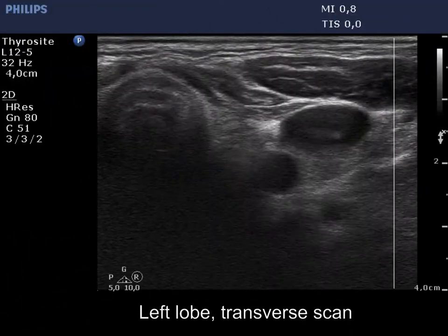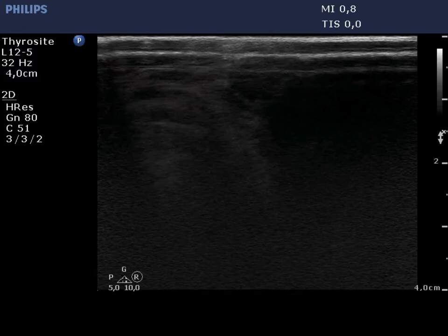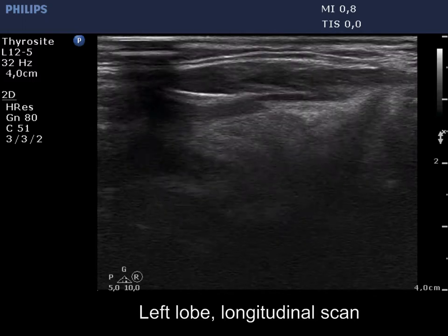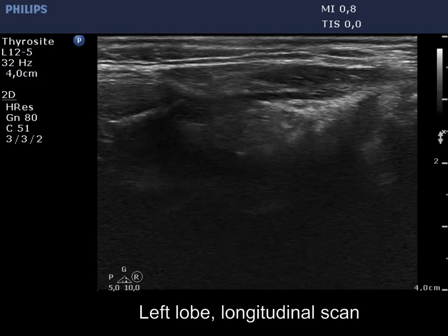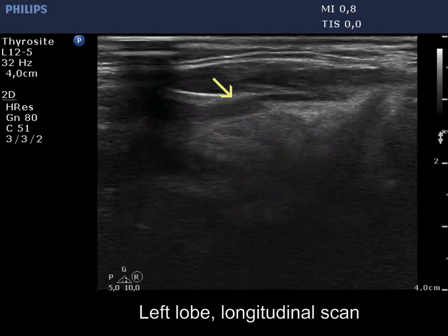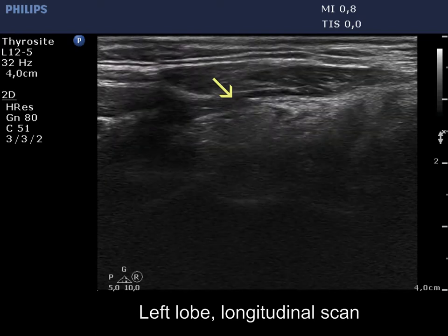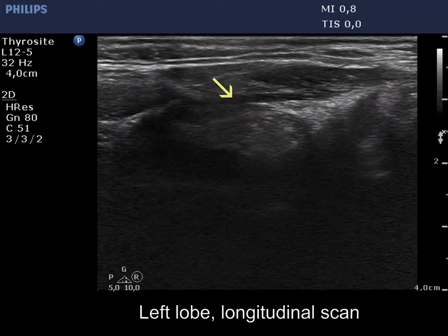Connective tissue replaces a great part of the left lobe, which has been resected for years. The ventral, moderately hypochogenic area with echogenic figures may correspond to the remnant.